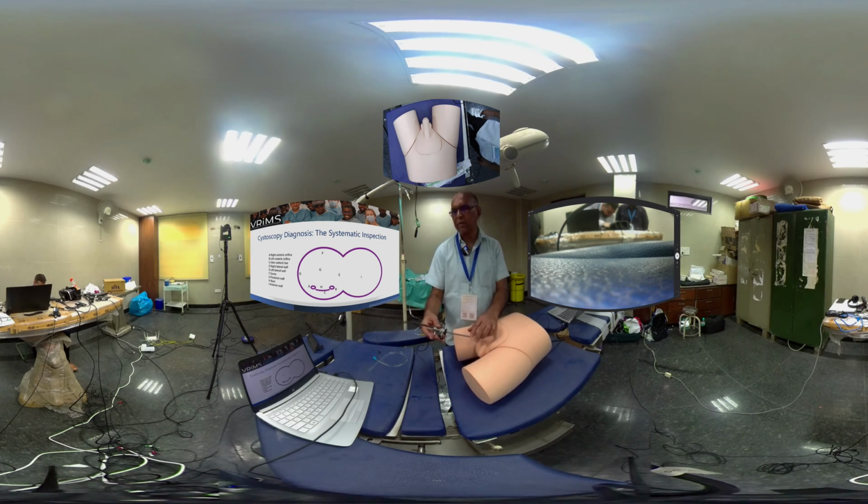So, overall you need to have a method of comfortably and accurately seeing the entire bladder. Then while removing again, you need to follow the curves and take it out under vision.